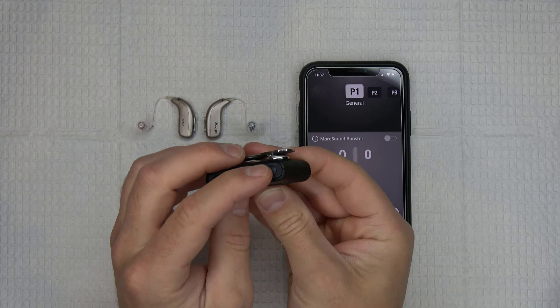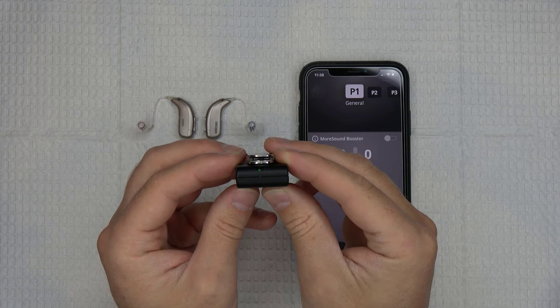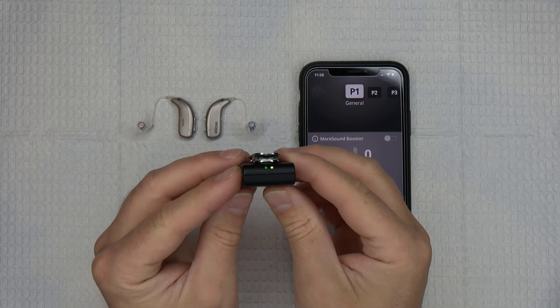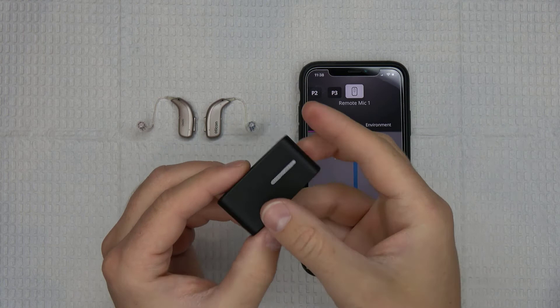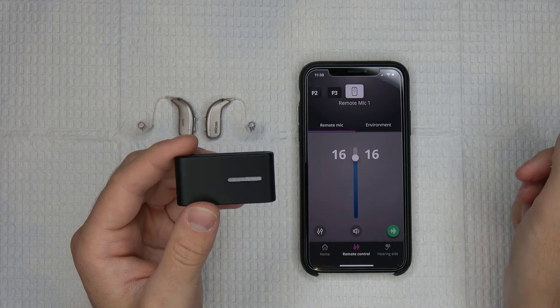To use the remote microphone feature on the Connect Clip, you need to first switch the Connect Clip on, wait until you see that it has established a connection with your hearing aids, and then switch into the remote microphone mode by pressing and holding the multi-button. Hold the button for approximately three seconds and you should see the indicator lights on the Connect Clip turn from green and yellow to a solid magenta color. The Connect Clip is now in remote microphone mode, and it will send audio information picked up from its microphone directly into your ears through your hearing aids.